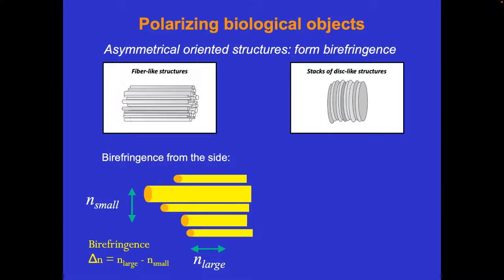This wave is actually slightly out of phase with the original one. So you add the original one to the secondary one, and you get a new wave that has a slightly different phase. It's this phase difference that slows down the propagation, and there you have your refractive index. The same holds for the scattering process, where you have a slight phase difference in the scattered field that slows down one wave with respect to the other, and there you have your birefringence properties.